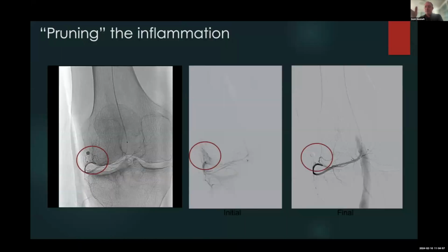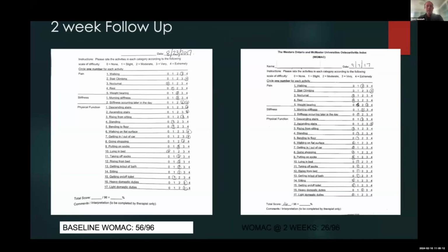So we're not aiming to cut it off at the trunk. We just want a little pruning of the hedges, and that's our goal. Now, why is that our goal? That's what we think is the best idea. We don't really know, but that's generally how we approach these hyperemic areas in the body, like fibroids and whatnot. And then, this is our results.